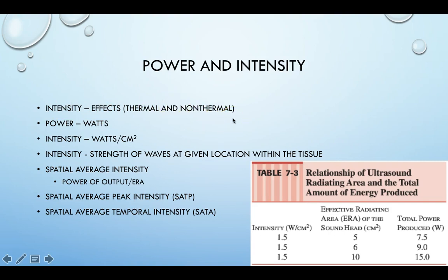And we can also manipulate that with how much time the beam is on, and we'll talk about that when we get to the duty cycle conversation. So the intensity really does tell us about the strength of the waves at any given location. Because we're dealing with an area, we're talking about the location within the tissue.